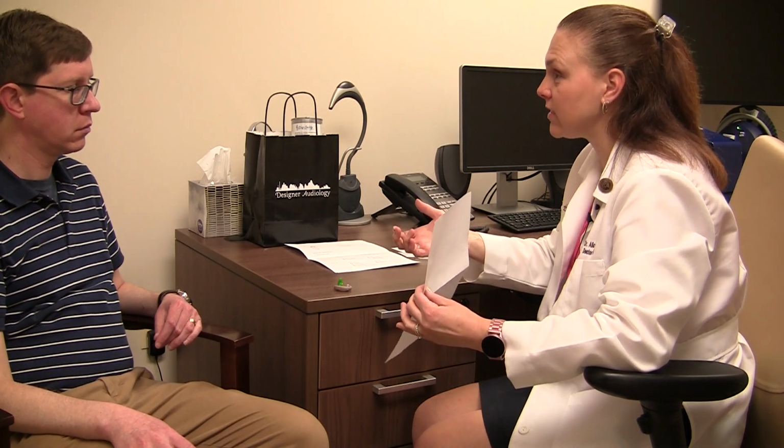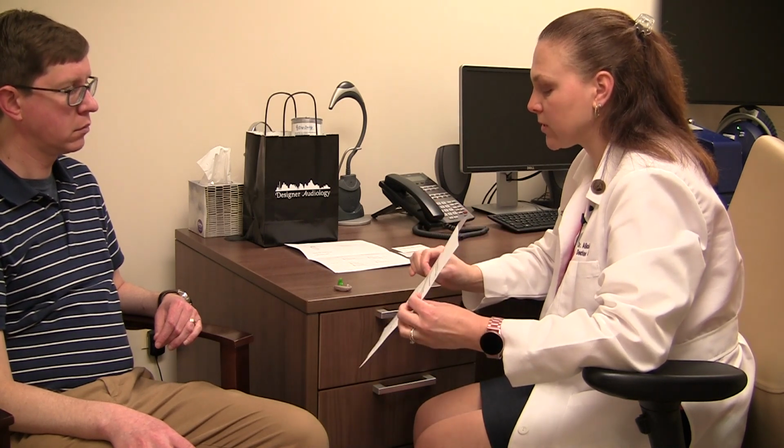Every 2 months, you need to change the little green disc in the dryer to make sure you're pulling out that humidity. And then again, every 6 months, you're going to come see me, and we'll get to that a little bit later. But again, public service announcements. Keep everything away from kids and pets. They're going to want to eat them.